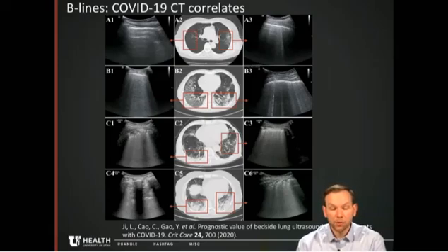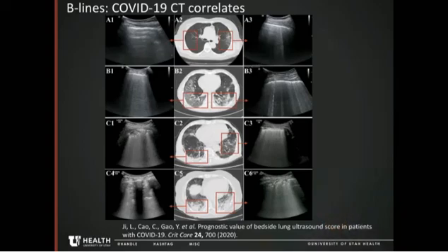And then finally, moving on to C5, this patient has undergone severe consolidation in the bases, again in that dependent position, and you're seeing hepatization of the lung on C4 going down more deeply, and then on C6, again with the subpleural consolidation.